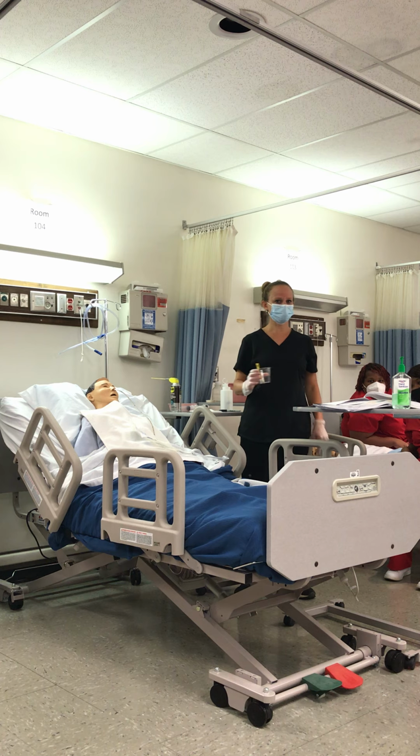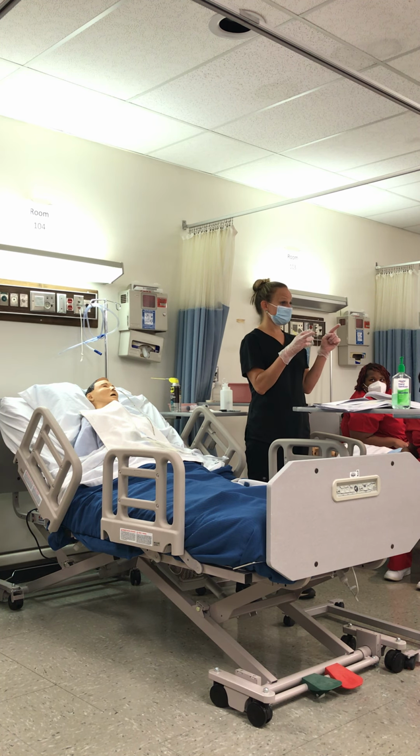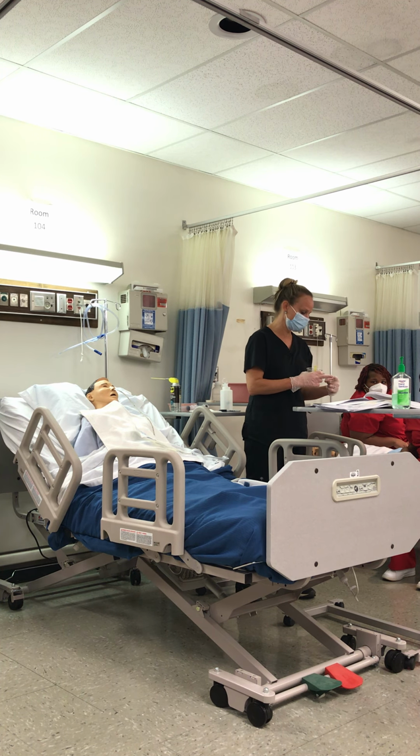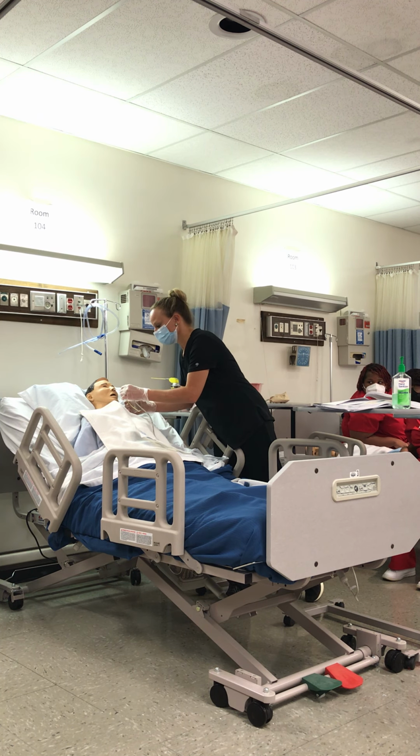That's 3. A dollar bill is 6 inches long. Okay? We like dollar bills. So, a dollar bill is 6 inches long, okay? So 3 to 5 inches. Normally this is gonna be 3 inches, like each phalange is gonna be like 1, 2, 3 inch, okay? So 3 to 5 inches, okay, take another swallow.